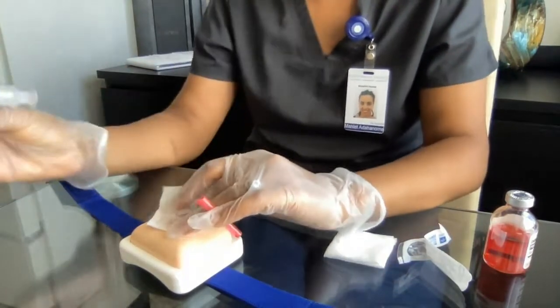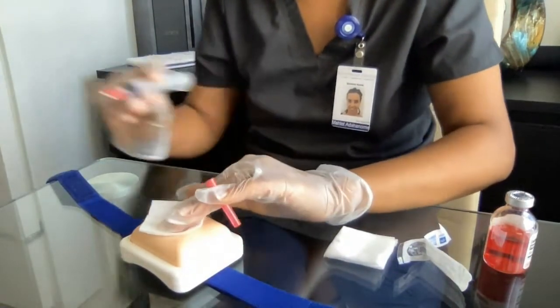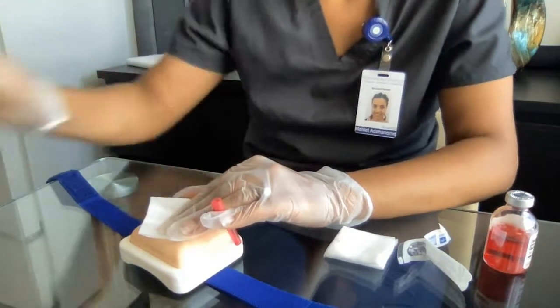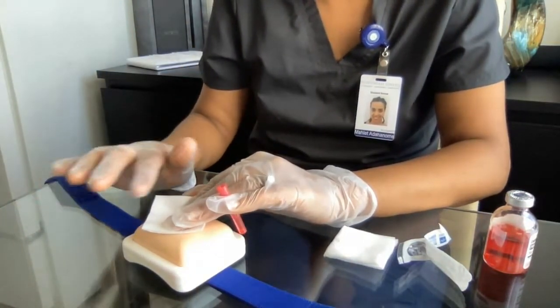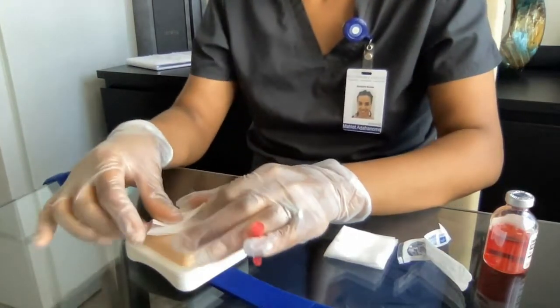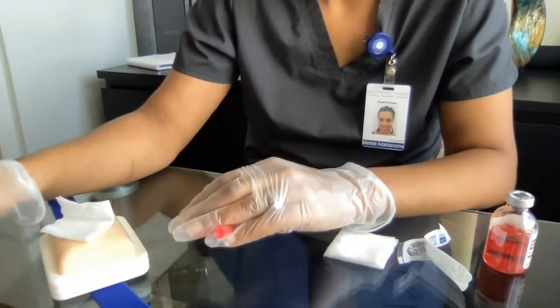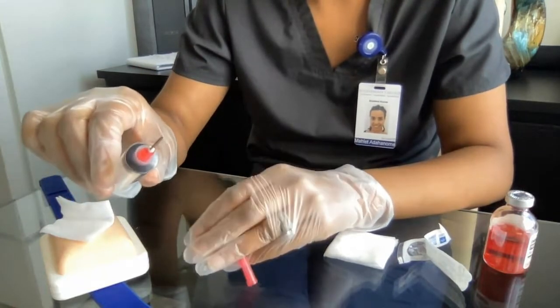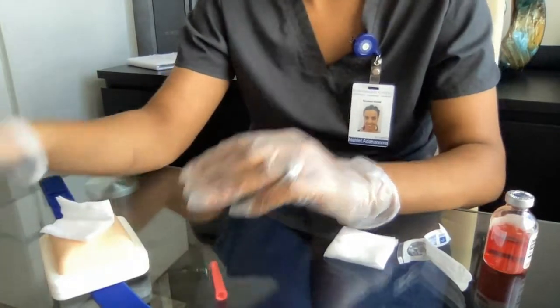Then I put a bandage or a gauze right after I take out the needle, just giving gentle pressure over the site. Do not massage, and apply a bandage if it is needed. Then I make sure to discard the needle and syringe in the sharps container. And now I'm going to remove my gloves.